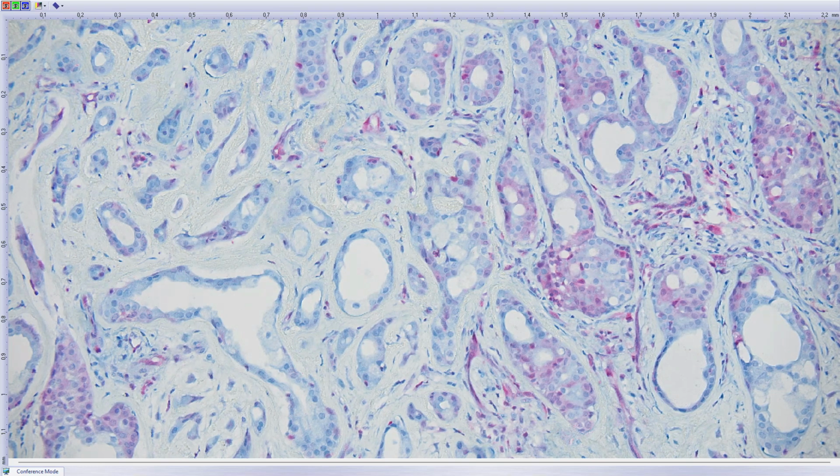And the name of the project is secretory carcinoma-like proliferations in sclerosing polycystic adenosis lesions. Do you have some questions about it? Yeah, I was mentioning that some cases were reported that secretory carcinoma are arising in scar. It may be so. It will be that this is exactly what it would be.